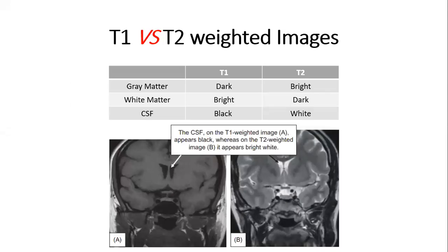First thing: how to differentiate between T1 and T2-weighted images? It is quite simple. The gray matter will be dark on the T1-weighted image, while it will be bright in the T2-weighted image. The white matter is inverted — it will be white in the T1-weighted image, while it will be dark in the T2-weighted image. The cerebrospinal fluid, like we see in these ventricles here, is dark in the T1-weighted image, while it is bright in the T2-weighted image.